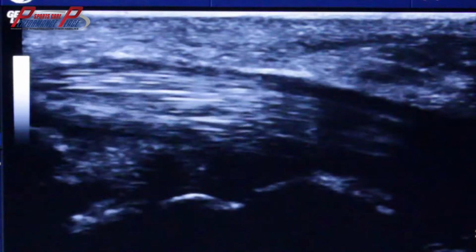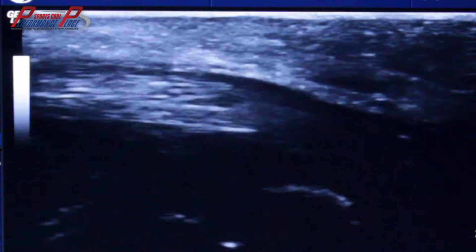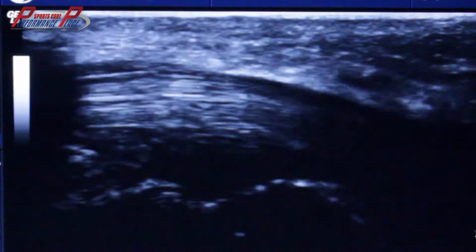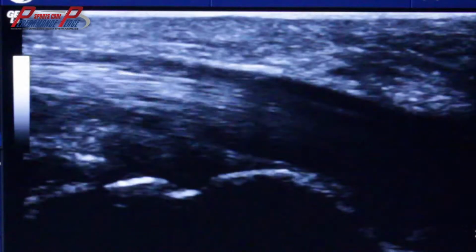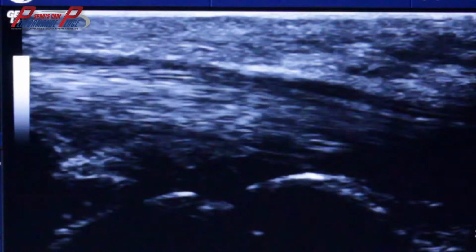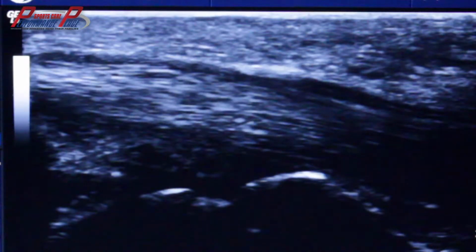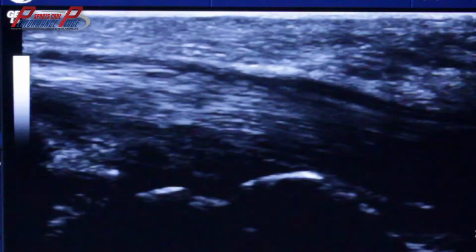A lot of times people will focus on the spine as being the area of mainly the nerve issue, but we can actually see that there are areas distal, on the extremity, which can be areas for entrapment where nerves don't slide as well too. I think I'm getting something right here, so I'm going to keep my fingers in a ball right here. I'm in a fist. Keep an eye on the interface between the actual black area and the tendon, which is that wider area below it.